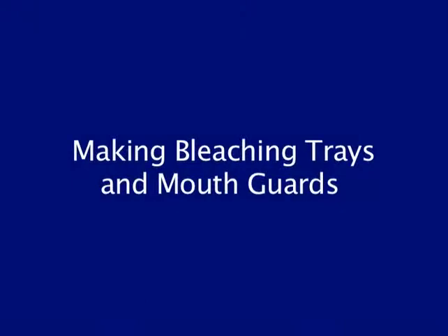To conclude this portion of our impression taking, we have covered the types of impression trays, how to care for them, what the differences are between the trays, how to handle an alginate, how to mix an alginate, and then also stone and plaster handling as well.